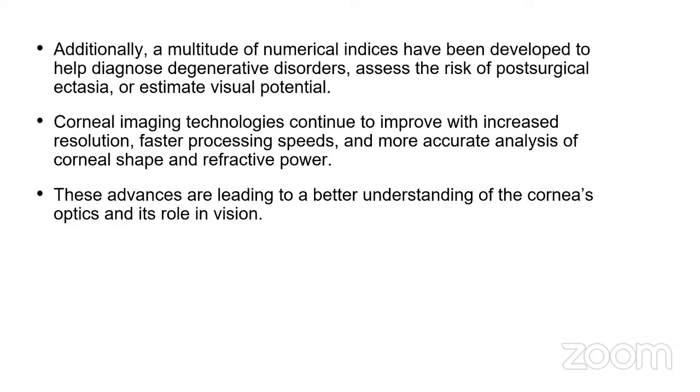Additionally, a multitude of numerical indices have been developed to help diagnose degenerative disorders, assess the risk of post-surgical ectasia, or estimate visual potential. Corneal imaging technologies continue to improve with increased resolution, faster processing speeds, and more accurate analysis of corneal shape and refractive power. These advances are leading to a better understanding of the cornea's optics and its role in vision.